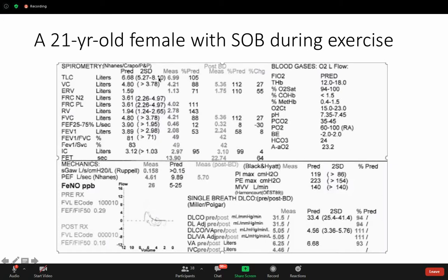their response, okay? And we pay attention to the FEV1 response, that's one. So you see here pre, it was 53, post, it was 58. So not far away from each other, okay? But look at the FVC, a vital capacity. It was 88, and now it's 112.